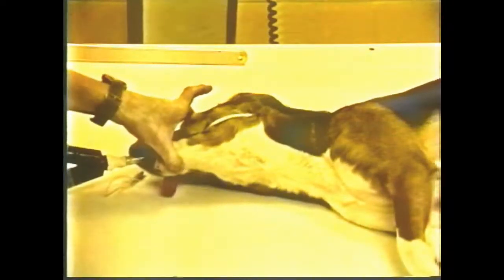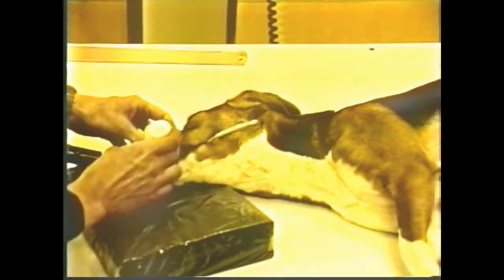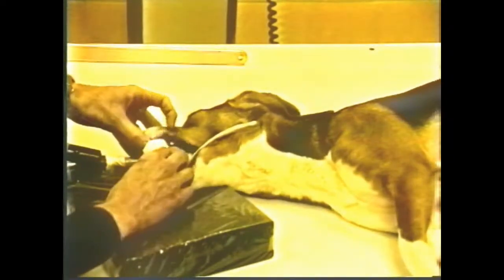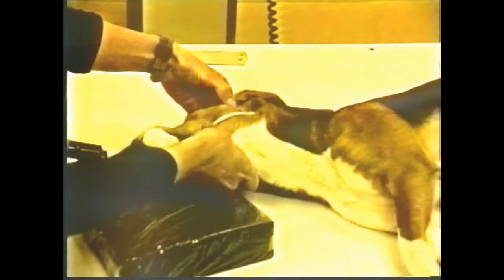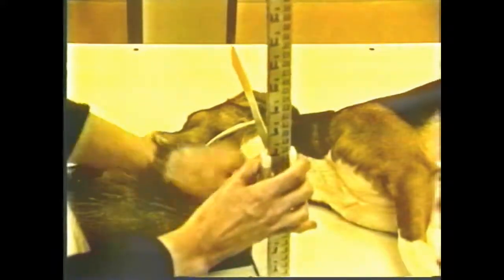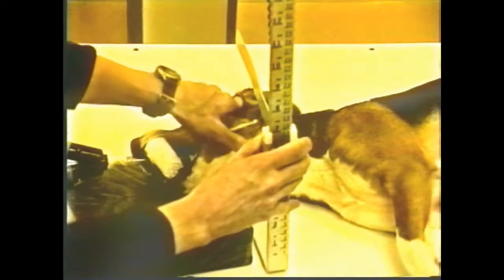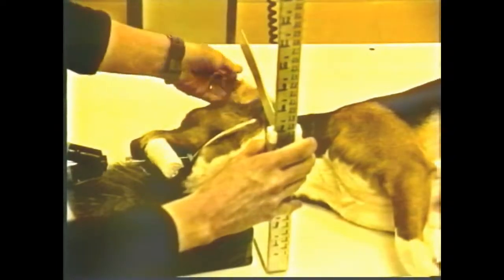This shows an animal being positioned for a lateral skull. Notice that the animal is under general anesthesia, and you must be aware that the anesthesia equipment, such as a tracheal tube, can add density and should be removed from the field as much as possible. The animal is on its side, and a wedge has been used to raise the mandible so that the midplane of the head is parallel to the tabletop.